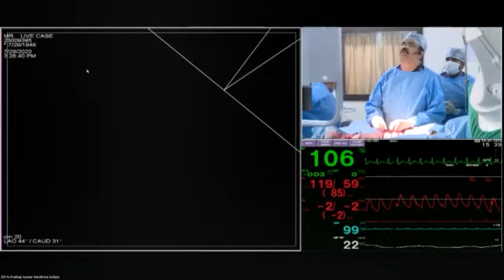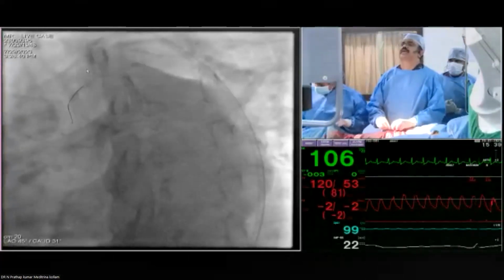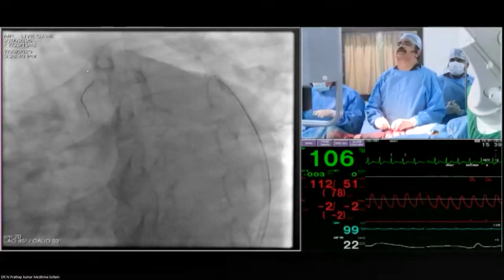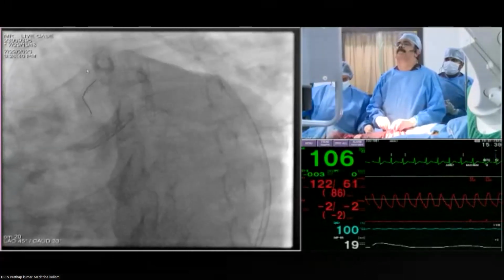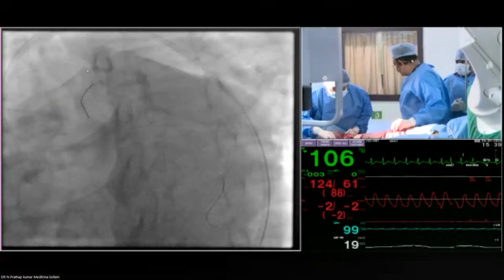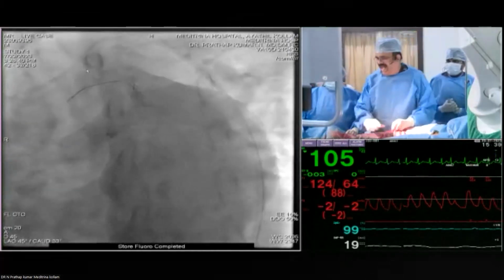After that, I have to show the final OCT. I think I have 7 minutes. I may be able to do that. You're going to make it look easy again, Dr. Prathap. We believe you. The wire is gone. There you go. That was a one-second crossing. Congratulations. Thank you.